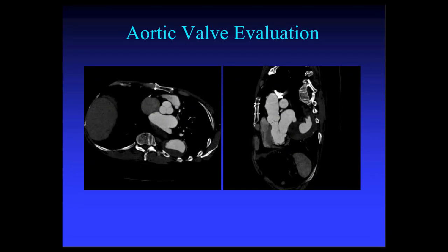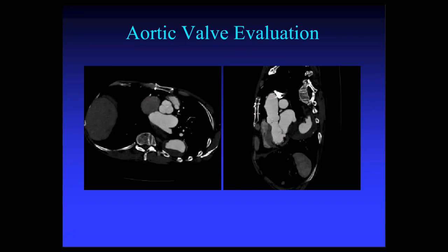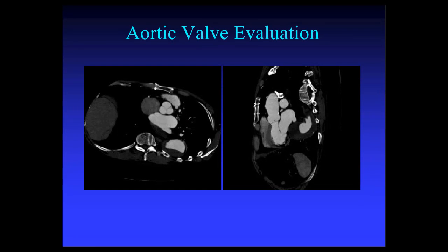Some of the standard views we will use, besides the axial oblique imaging, include a left ventricular outflow tract view on the left — a very important and helpful view of the aortic valve, particularly its relationship to the anterior leaflet of the mitral valve. These anatomic relationships are important for surgeons and referring physicians for evaluation of the aortic valve.